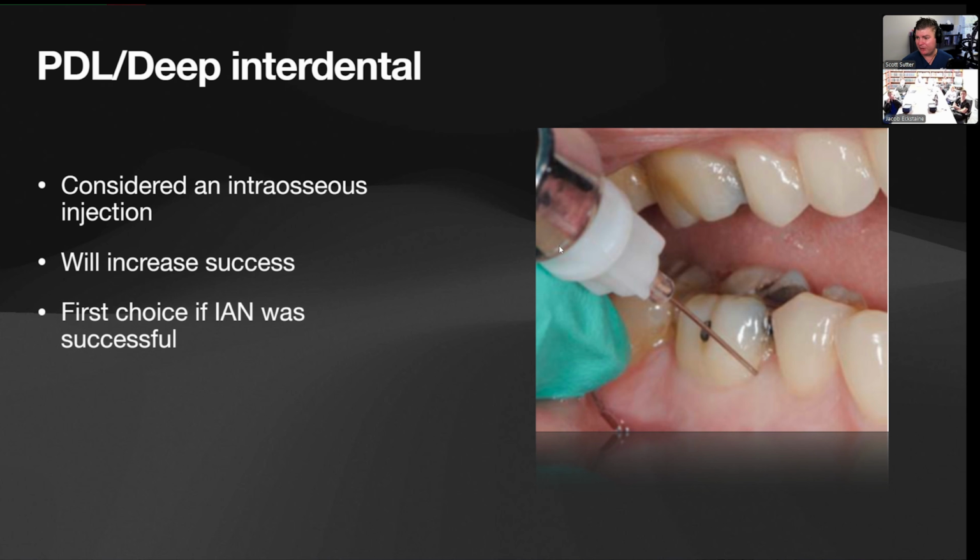When you're giving this, you want to use a short needle. I do recommend getting 25 gauge for these, because since switching to 25 gauge needles, I haven't given a true traditional intraosseous, like a drill hole, because there's no need. This stuff works so well. You're going to go in at about a 45-degree angle coming down, just like you see here. I go right in between the papilla and hit the bone. I give a little bit, then push a little harder, trying to pop through that cortical plate, because it's pretty thin in this area.